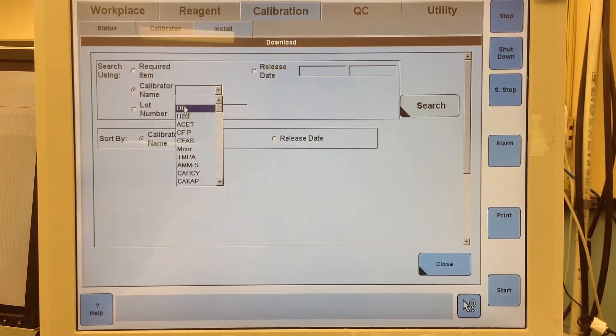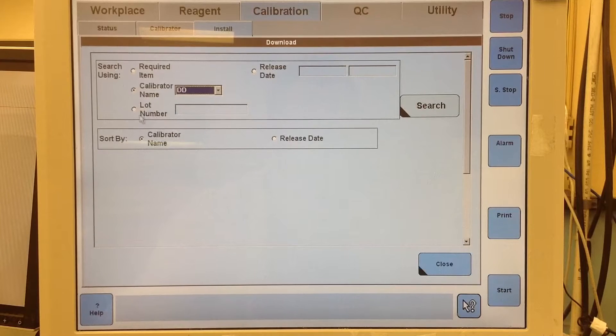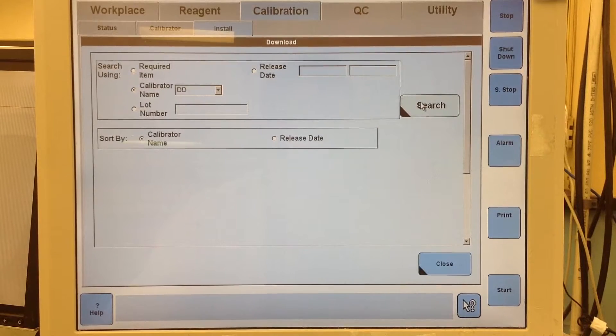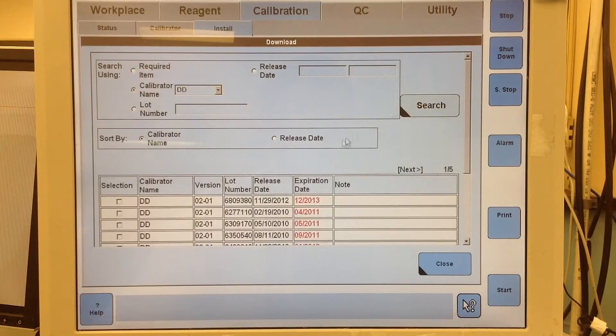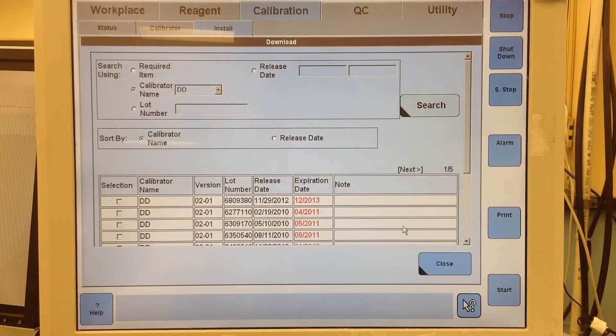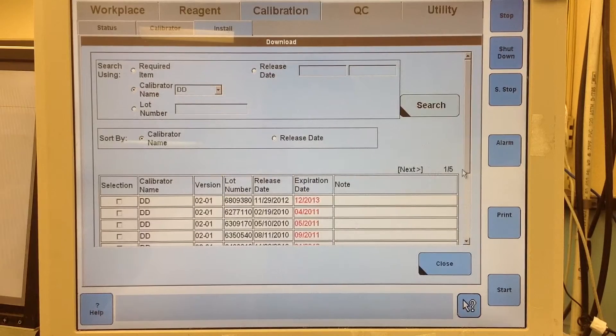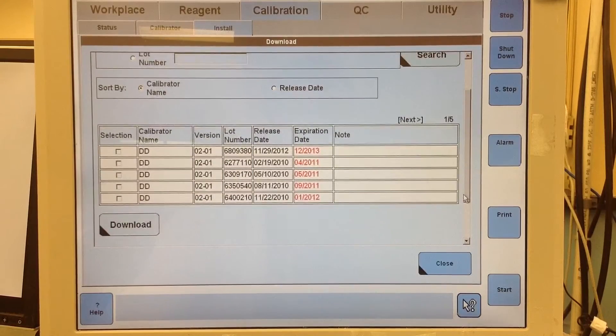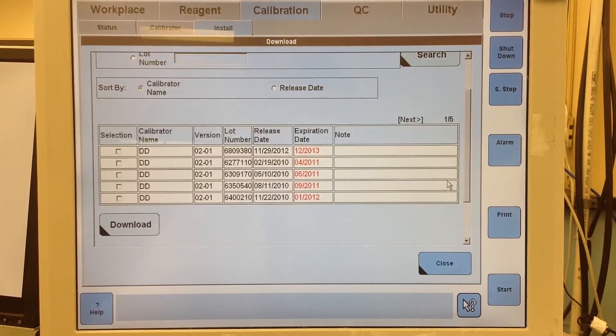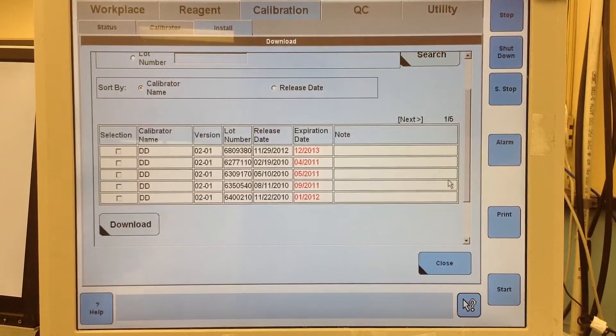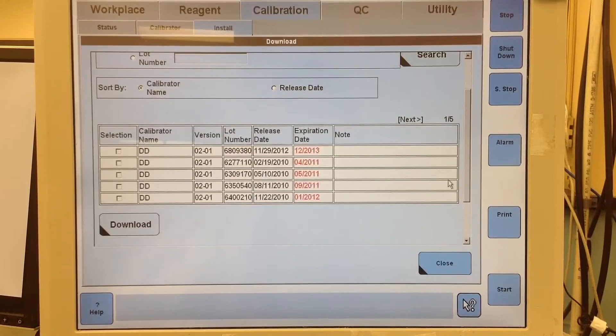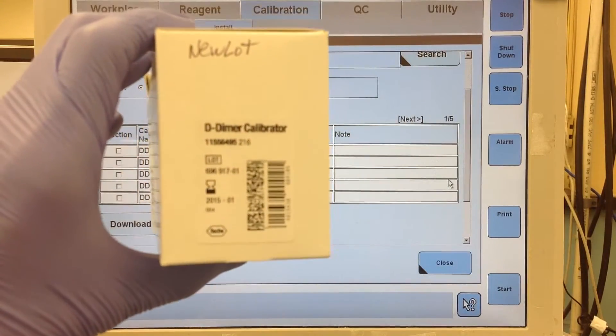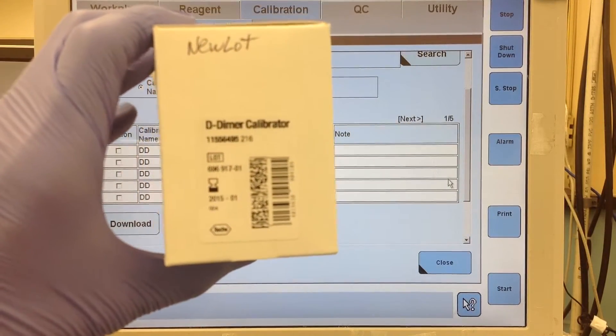So it's at the very top. When you're there you just hit search. It's going to bring up all of the current lots that they have programmed. So let's go ahead and see what lot I have. So this is the lot that I have.